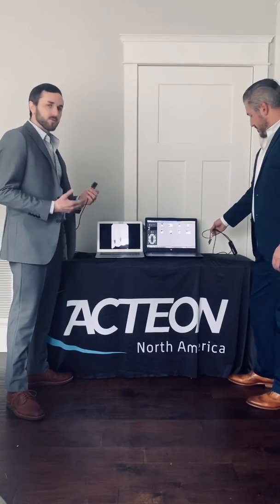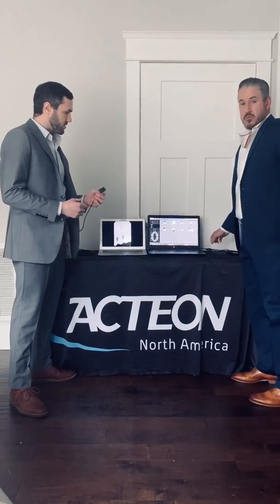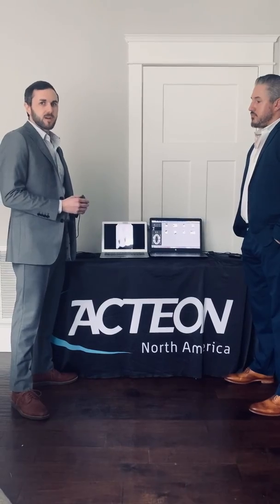One thing to remember is we have two sizes, and sometimes that's referenced as a child and adult, but it's more important than that — it's really about having the right sensor for the right clinical application. Regardless of the patient's age, it's really about having the right size to get the right diagnosis for that clinical application.